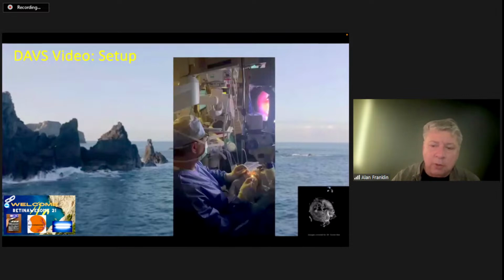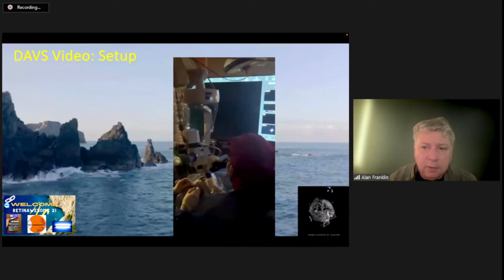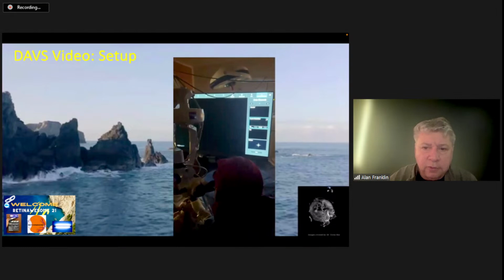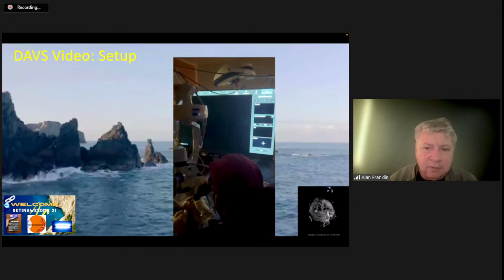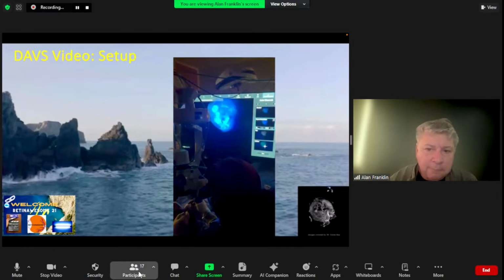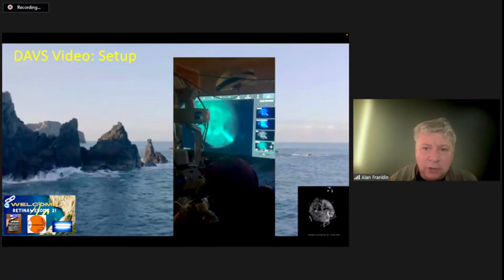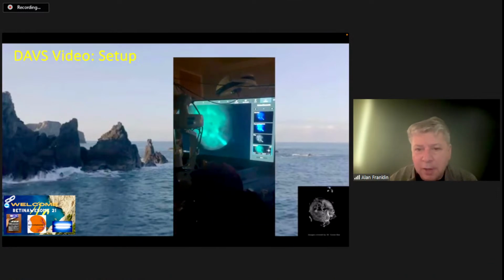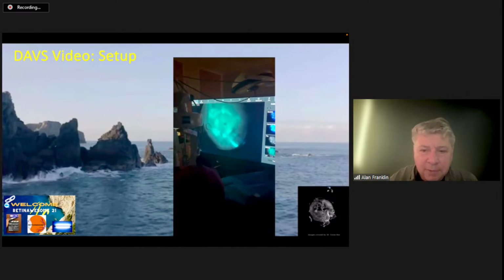This shows you how quickly we go to fluorescein. Let's go to fluorescein. My anesthetist is starting to inject, and the fluorescein's in, and we're just watching it fill. Obviously, the screen won't be all that clear. We're just doing a shot on the Ingenuity.